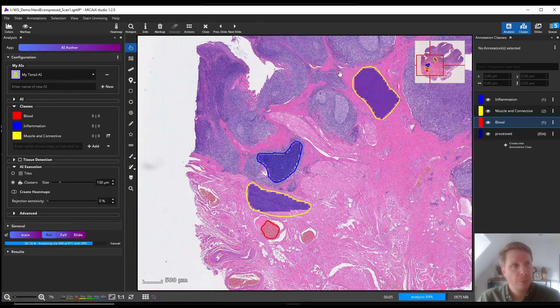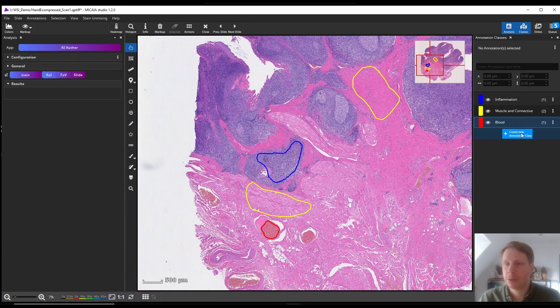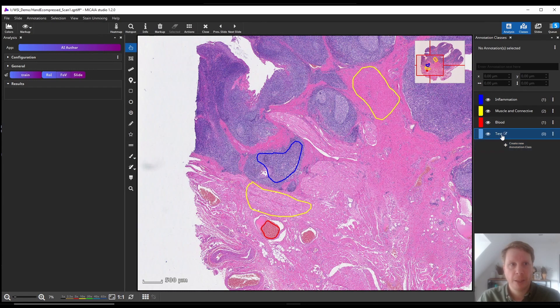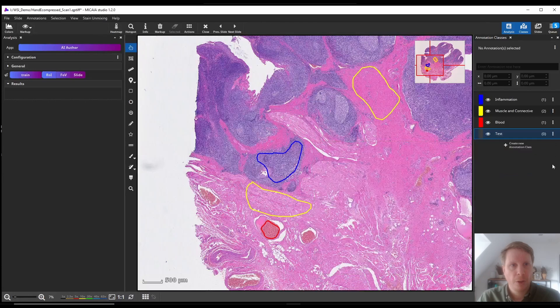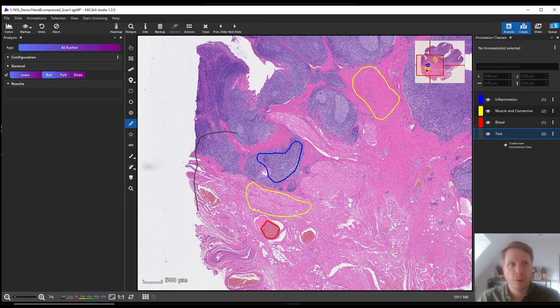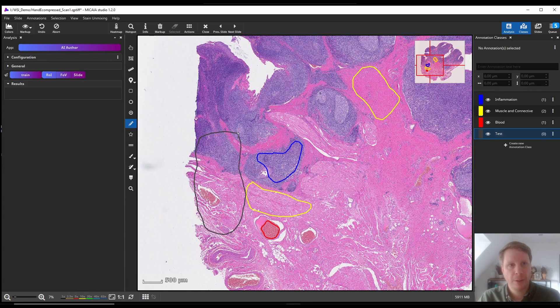Now we can try out how it performs on a different region in a slide that we did not annotate. I'm adding a new class here called test, drawing a region of interest that contains all these different tissue types, and then we can see how it performs. This time I didn't click Train — I click Analyze Region of Interest.